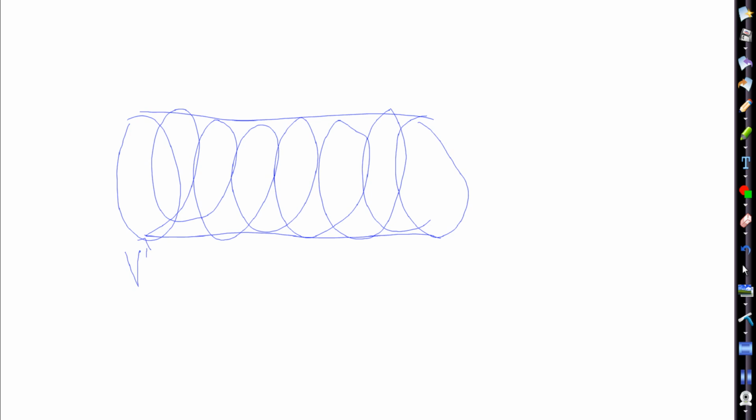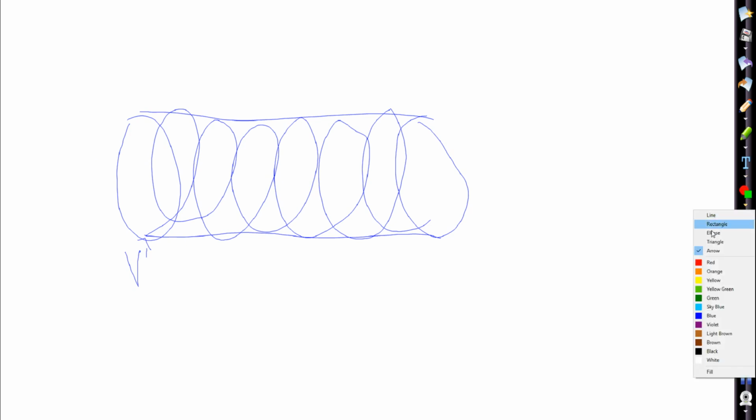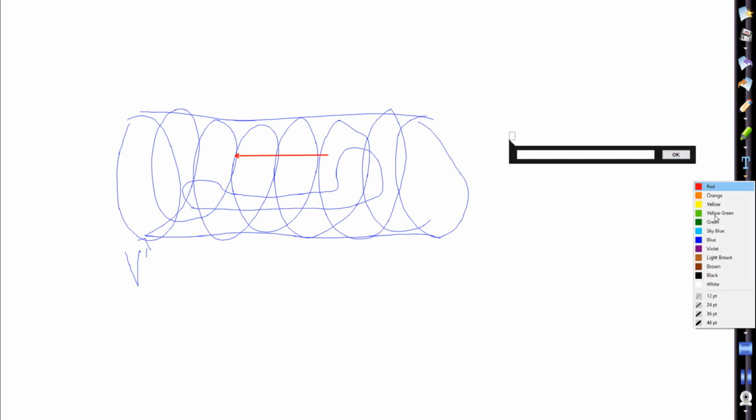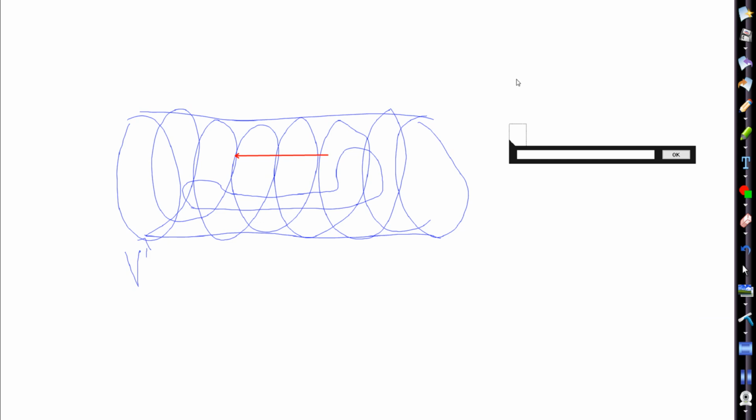So if we had to show the different components of the magnet, starting with our patient. Here's our patient right in the middle here. From the inside out, give me the different layers. So starting with this layer right here, closest to the patient. Alright, good. Let's increase the size of it. It's our radio frequency. Alright, what's the next layer?